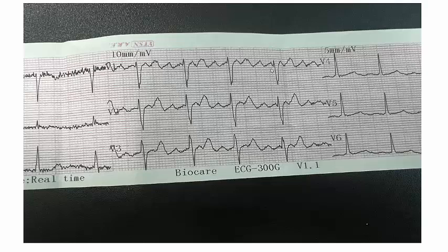You cannot use the E over A ratio in assessment of the diastolic function of a patient with atrial arrhythmia or reverted from AF, because the stunned atrium will make the contraction of the atrium very poor and will make the E over A ratio too high. So this is very important.